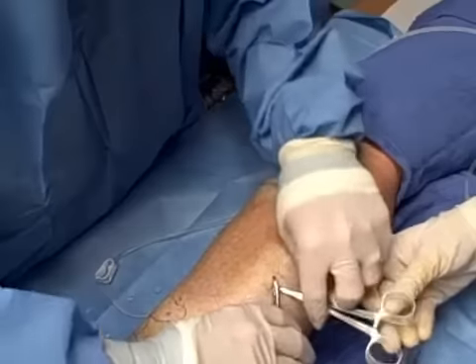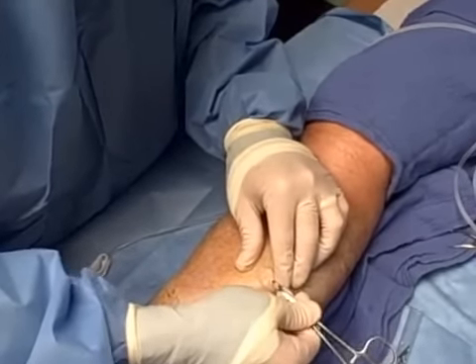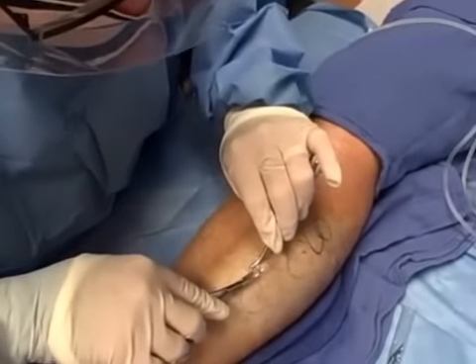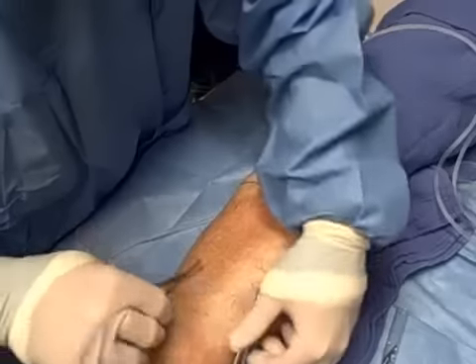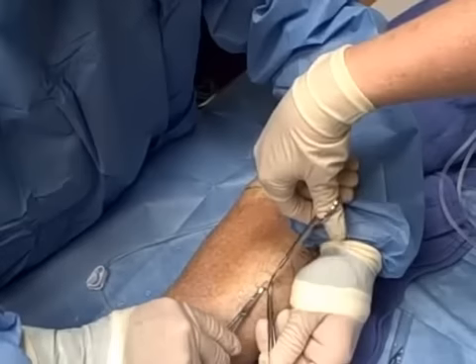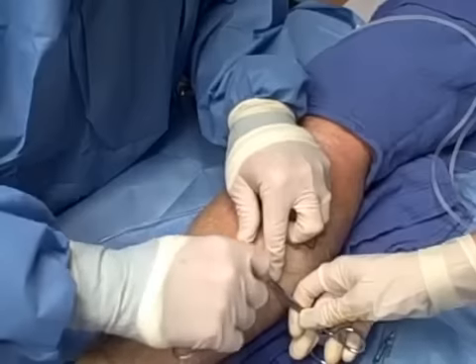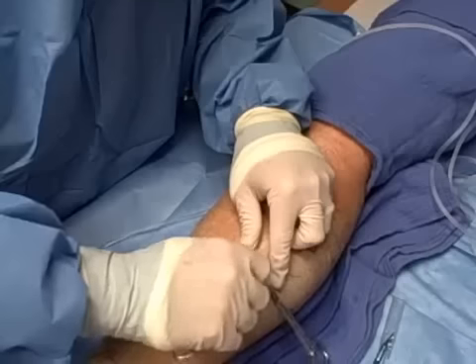We'll give you a better look here. Just tugging. What we like to try to do is split the vein in half — it will give you a little bit better view of it. I just take one hemostat, put it on one side, then hemostat the other side, and we're just going to cut that right there. That's the vein — that's a varicosity. We've got it on two sides and then we usually just pull a little bit again. Patient, we doing okay? Yes, he's doing fantastic.